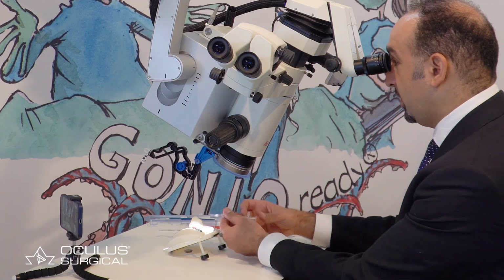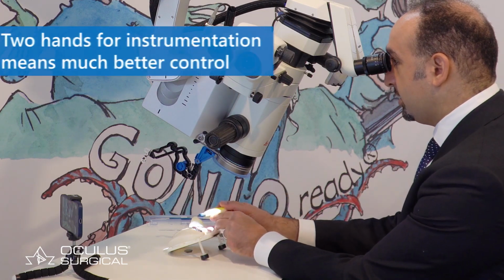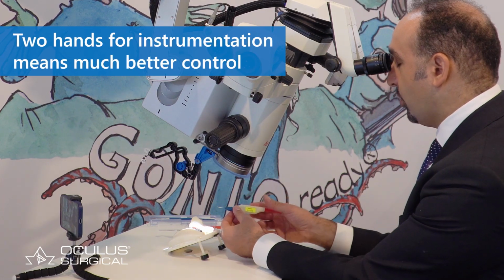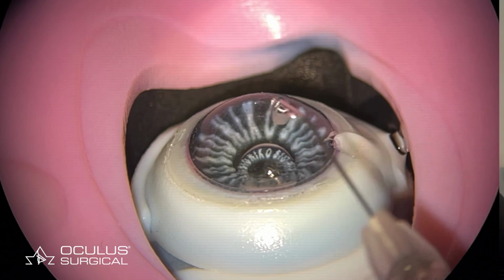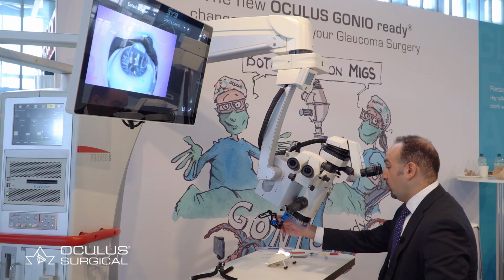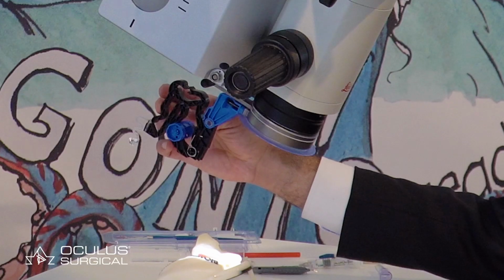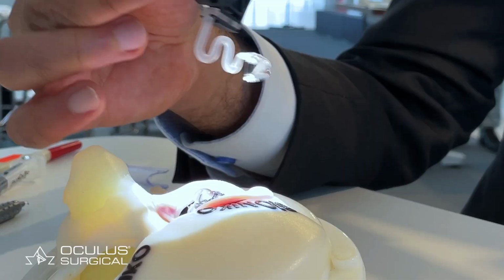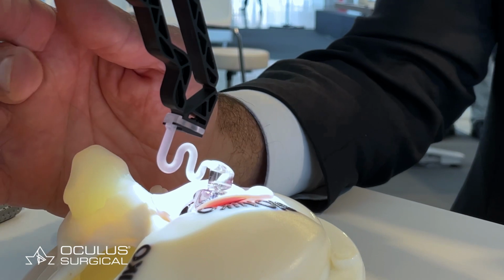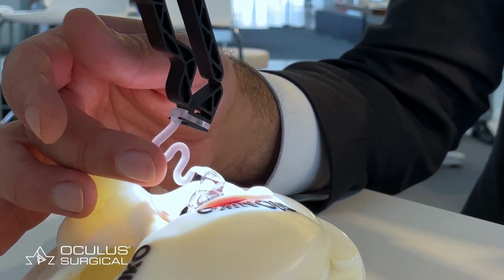The advantage here of the Gonio Ready is that of course it's hands-free, so one can use two hands to control the instrumentation for the Hydrus, which I think will give much better control. We'll place some OVD on the eye. We will now bring down the Gonio Ready system, pressing in on the device, which simply swings over and we'll make contact with the eye. We can use XY here on the operating room microscope to bring the Gonio Ready onto the eye.